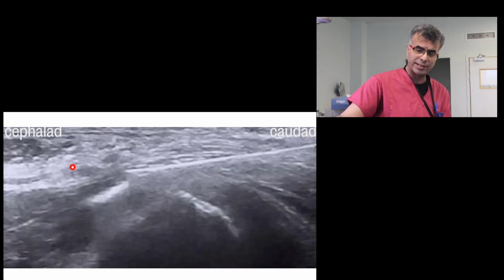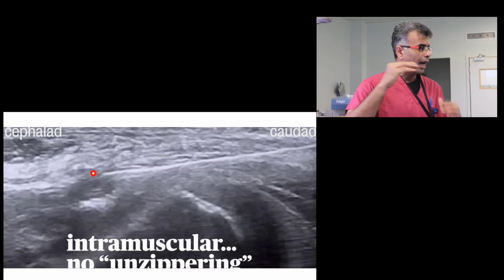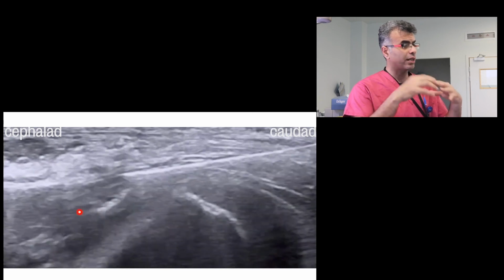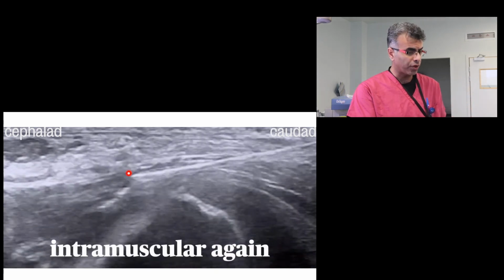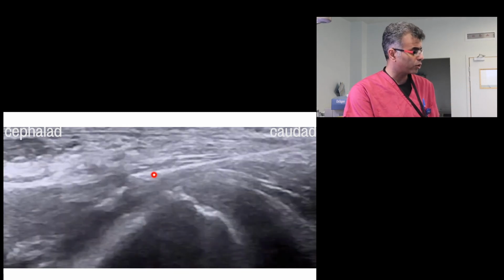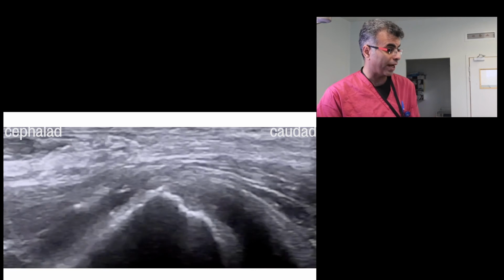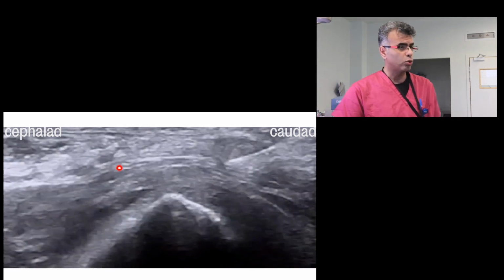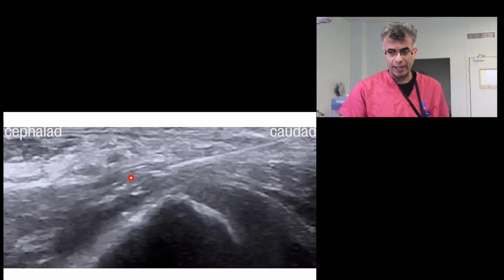And the idea is to create a pocket of local anesthetic where you're injecting above the iliacus muscle, below the fascia iliaca, and injecting a larger volume as proximal as you can to involve the three nerves, which are the lateral cutaneous, the femoral, and also we hope the higher branches of the obturator, to give you very good analgesia for femoral and hip fractures here.